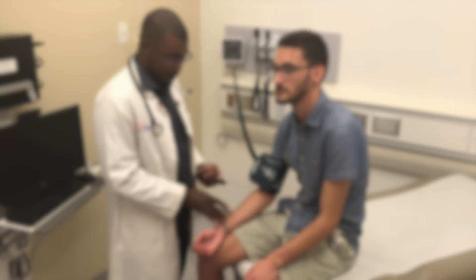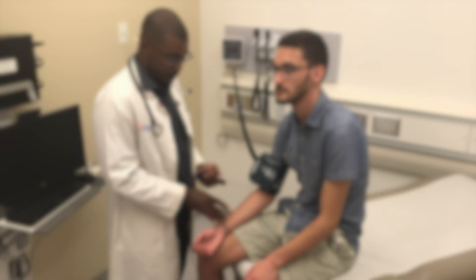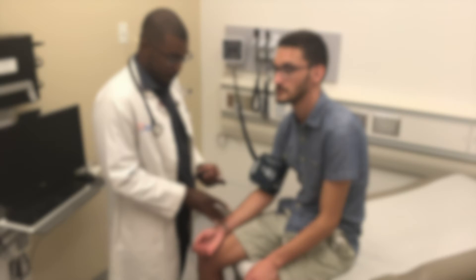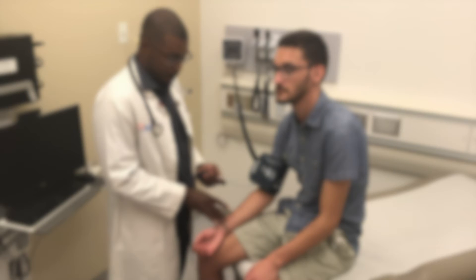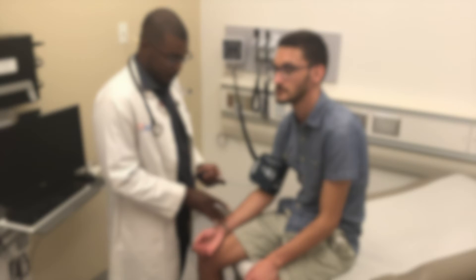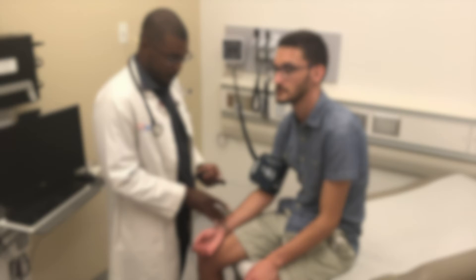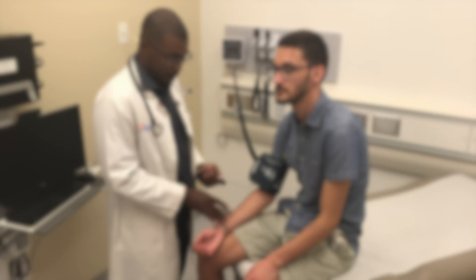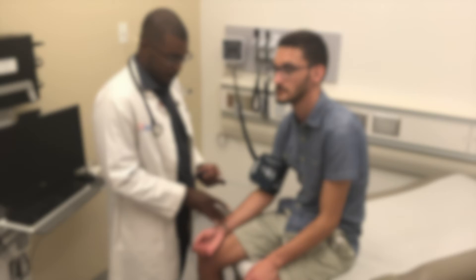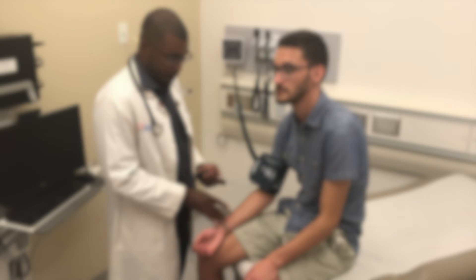If you were following the standard method of blood pressure measurement, you would inflate the cuff to 180, hear nothing at first because you were within the auscultatory gap, then begin hearing Korotkoff sounds at 160. In this way, you would be tricked into falsely thinking that the systolic BP was 160, completely missing the patient's true systolic blood pressure of 220. By utilizing this special test and assessing the blood pressure with the aid of pulse obliteration, we can completely avoid this problem.